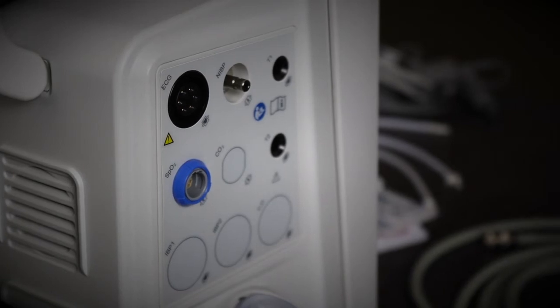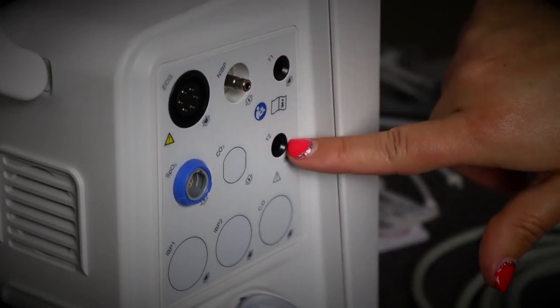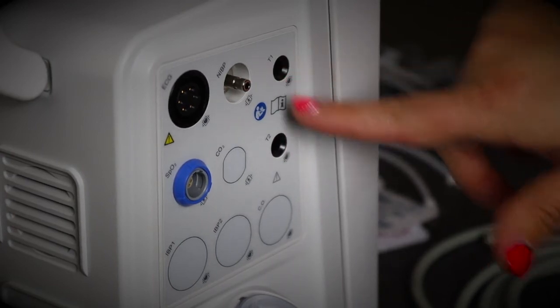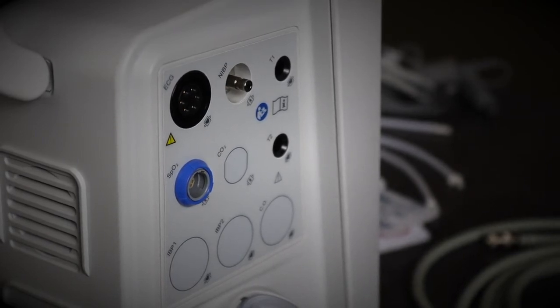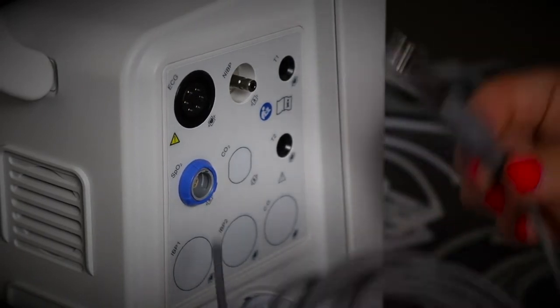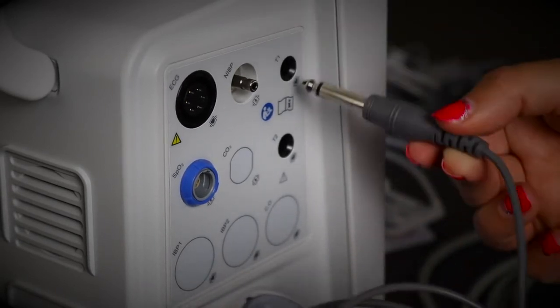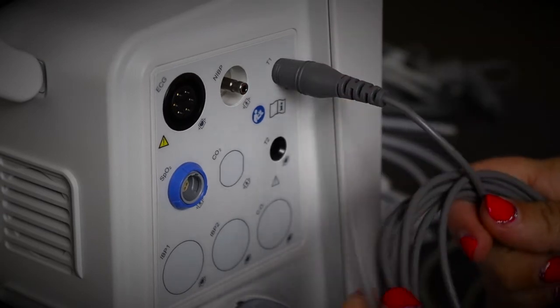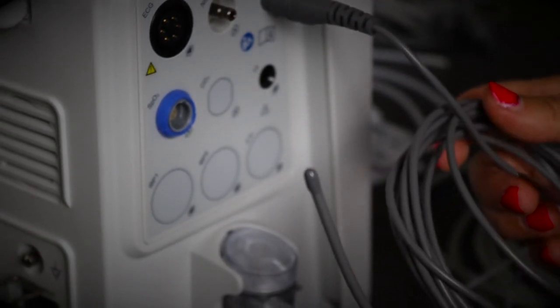I'm going to talk you through how to place a temperature probe. On the side of the machine you have two holes for temperature, meaning you can use more than one probe at once — just a rectal temperature, just an esophageal temperature, or both. It doesn't matter which port you use if you're only using one; it can be T1 or T2. This end connects to the machine and the other end connects to your patient, either rectally or esophageally, and these can be cleaned and reused.